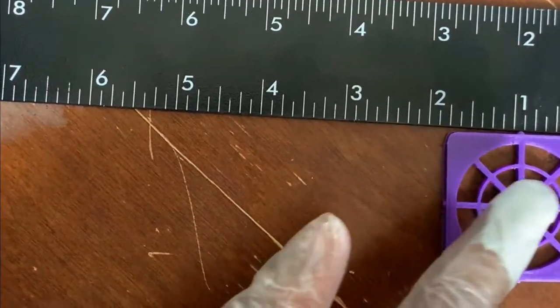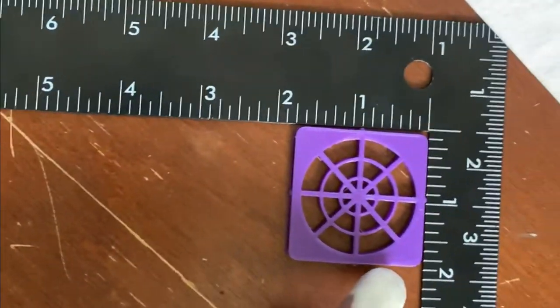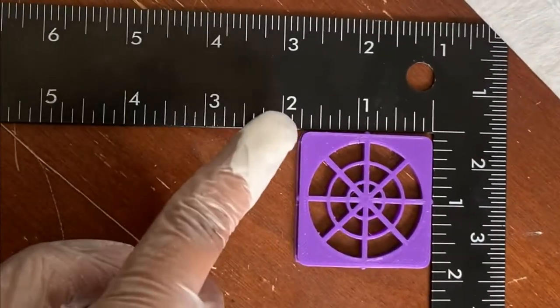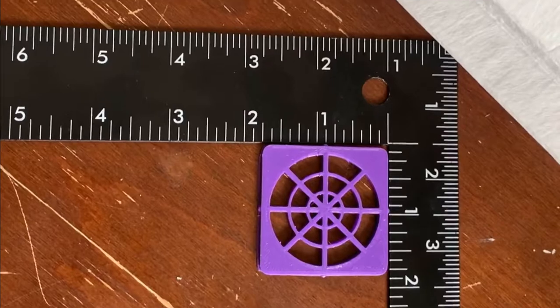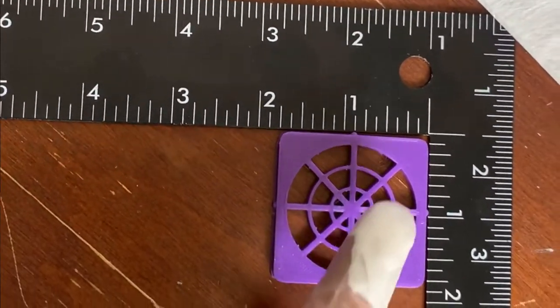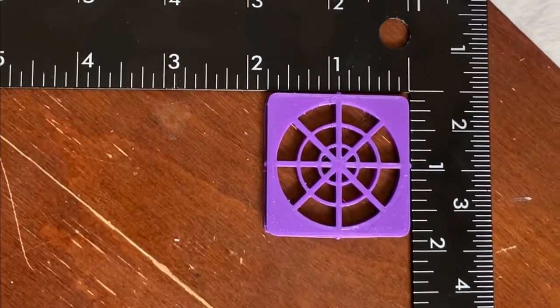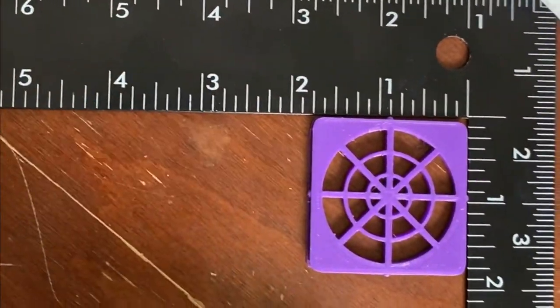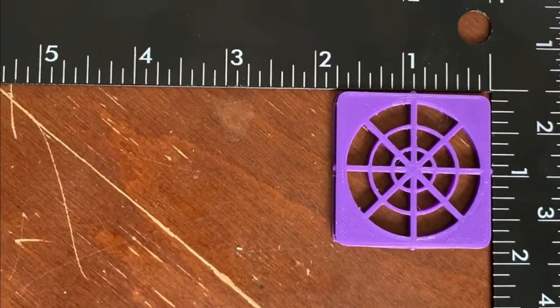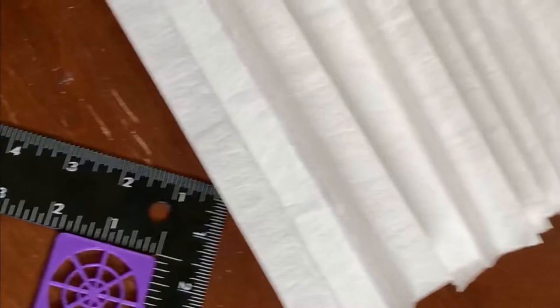The length of the filter material should be slightly more than the length of this — slightly more than one and a half inches, or slightly less than two inches on both ends. So I'll just cut a piece of square out of this material.